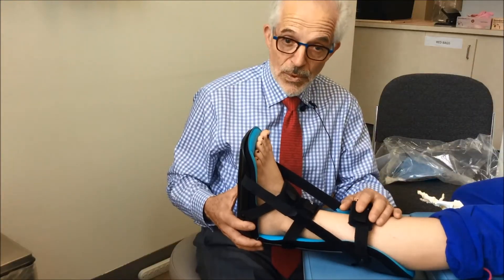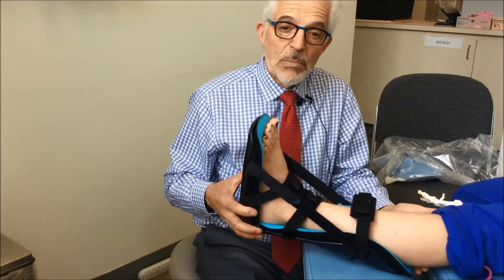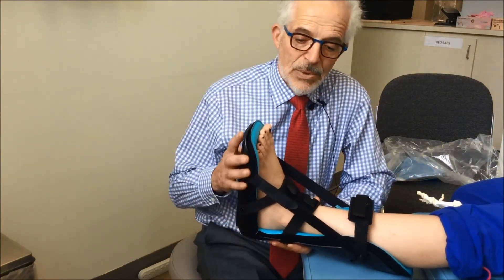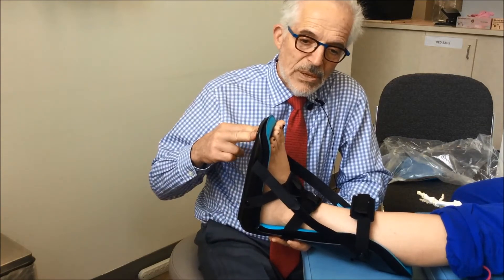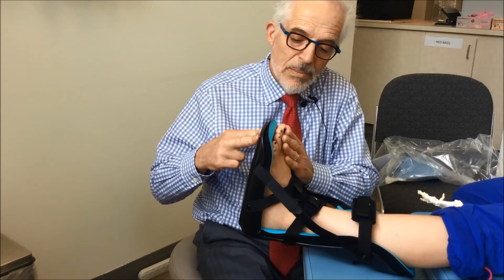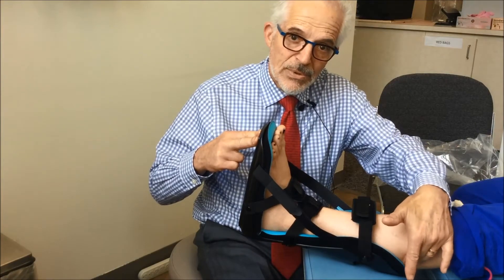The splint needs to be worn with the knee straight. That places the most stretch on your calf muscle. We need to be able to gradually tighten these straps, so that very slowly, over a couple of weeks, we can increase the amount of motion of the foot coming up, thus stretching out your calf muscle.